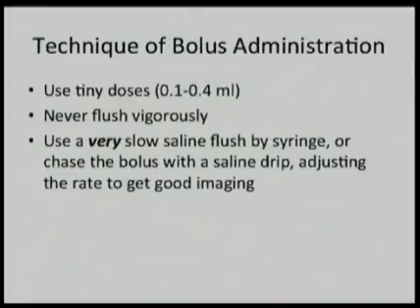The technique of bolus administration is shown here. And we'll get to contrast infusions in a minute. There's basically 2 ways to do this, a bolus or an infusion. If you're going to use a bolus, you should use very tiny doses. I find that people often think that because this comes in a 1 cc vial, they should give a full 1 cc. Well, in fact, you can get away with 1/10 of a cc, or maybe up to 0.4 cc's and get a beautiful result.